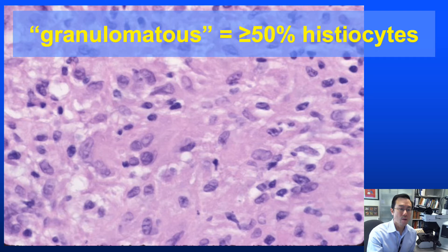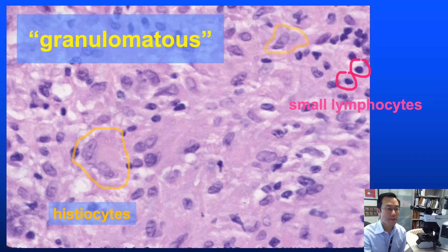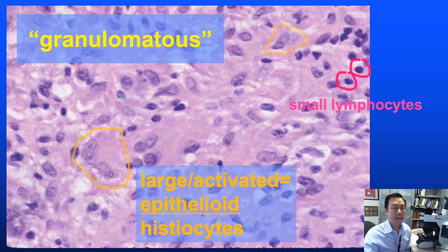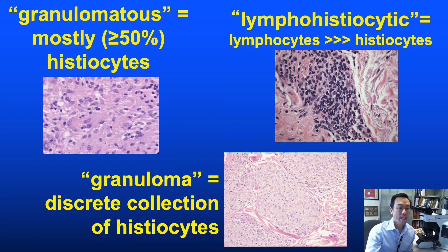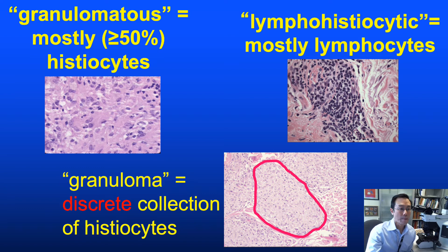In contrast to 'granuloma,' the term 'granulomatous' is slightly less strict — a discrete aggregate of histiocytes is not required. As a basic rule of thumb, an infiltrate containing 50% or more histiocytes may be characterized as granulomatous. The discrete granuloma is a subset of granulomatous inflammation, and typically more than one granuloma can be seen.